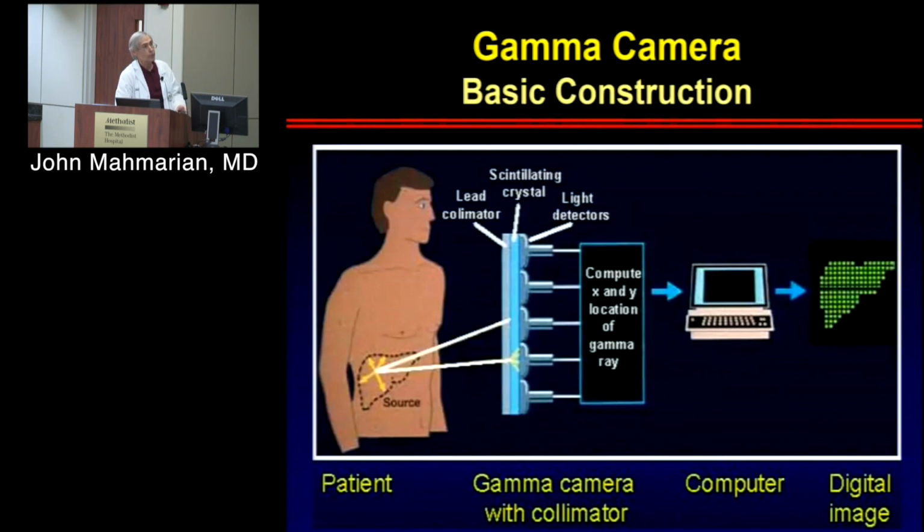And this is usually a sodium iodide crystal. We now have CZT crystals as well. We'll talk a little bit about those.